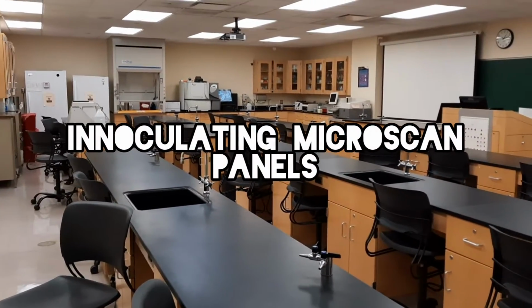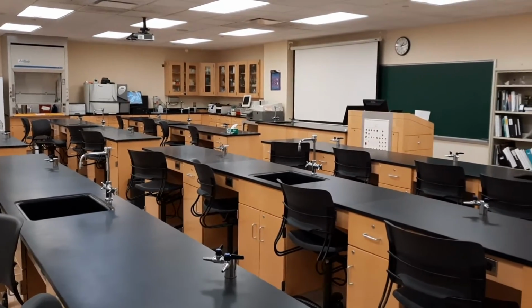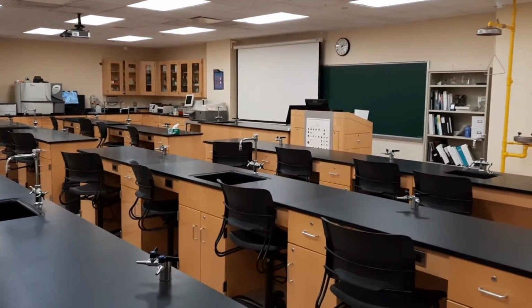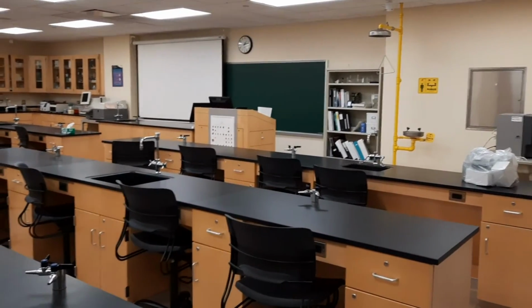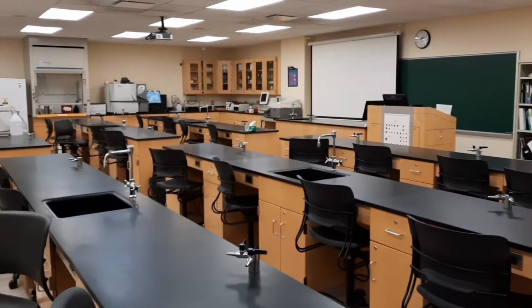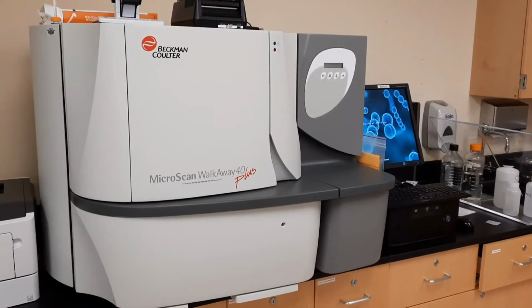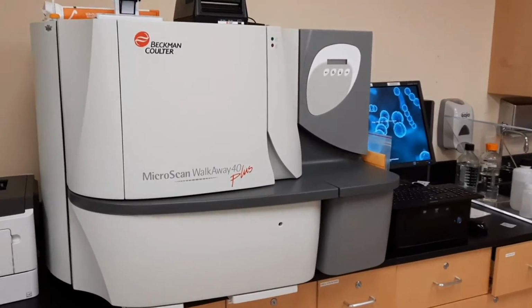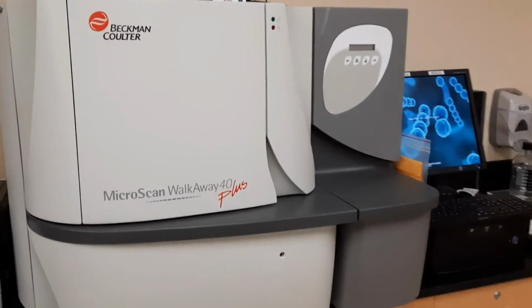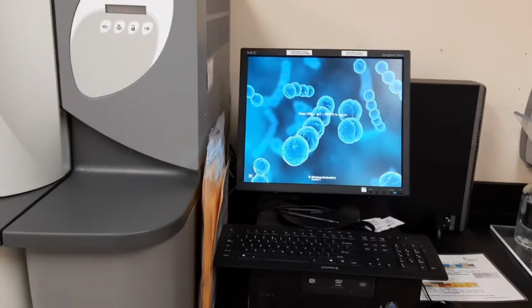Clinical bacteriology laboratories equipped to diagnose bacterial infections and perform antibiotic susceptibility testing are scarce in low-resource settings. Correct identification of bacterial infections is necessary for appropriate antibiotic treatments. The MicroScan WalkAway is an automated benchtop analyzer that uses biochemical reactions to identify bacteria down to a species level.